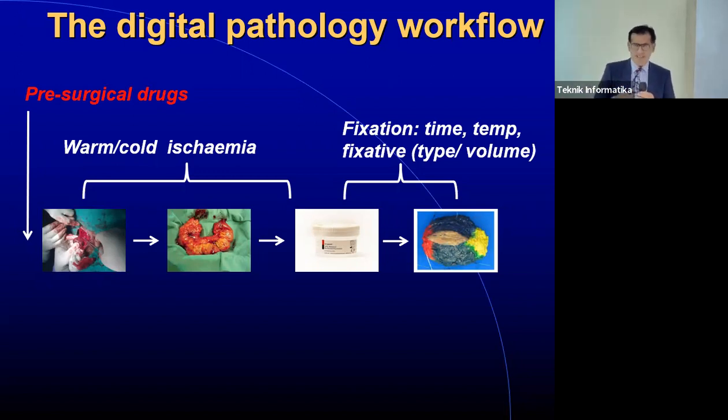Okay, so I hope you're getting depressed, because there's more depression to come, right? We've only got to the fixative point yet. So this is a breast tumor. We're not going to examine this as it is. What we need to do now is chop this up into smaller bits and then take some tissue sections. Okay, you think that's going to be easy, right?